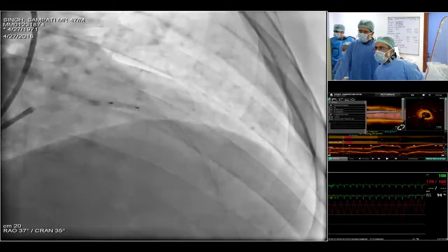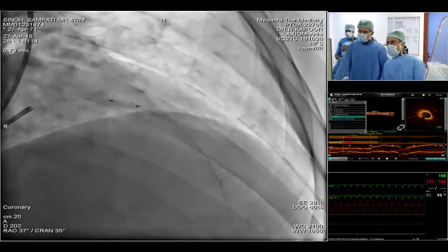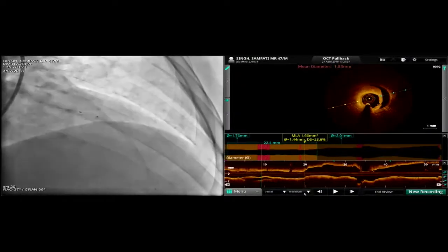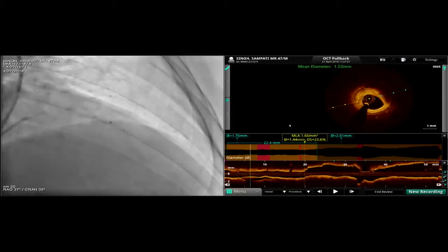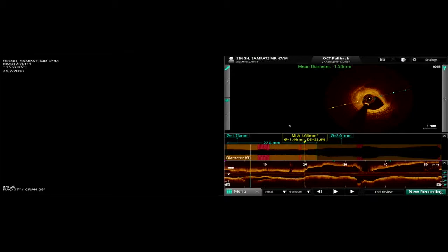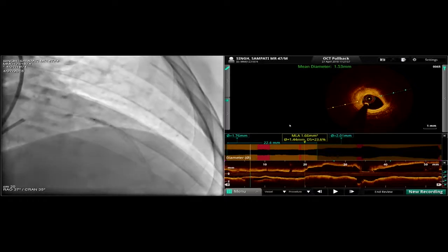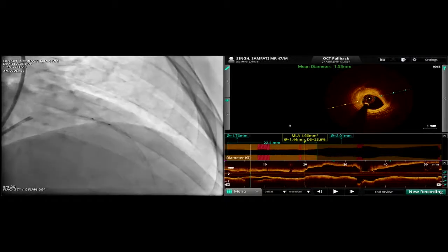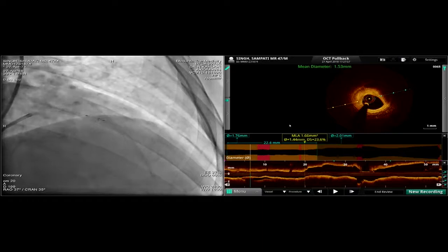18, 20, 21 down. 20 down. 18, 20 down. 22, 23. Go. 20, 23 down. Check.